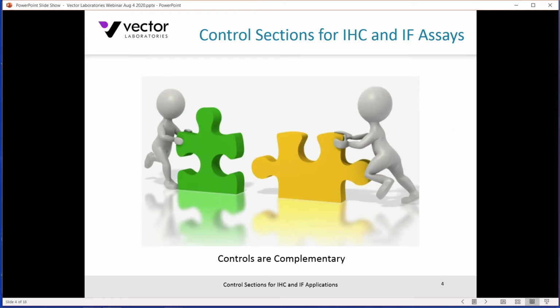Let me just deviate here a little bit and tell you why we put this webinar together and why we feel that controls are an important topic. We do encounter investigators who apply these controls, positive and negative, infrequently or inappropriately. And what this leads to, unfortunately, is non-reproducibility by them, or by others who want to build on their research, and that's certainly disappointing.